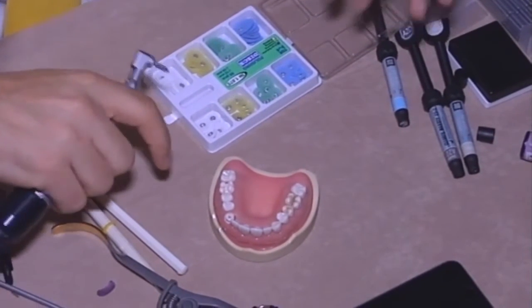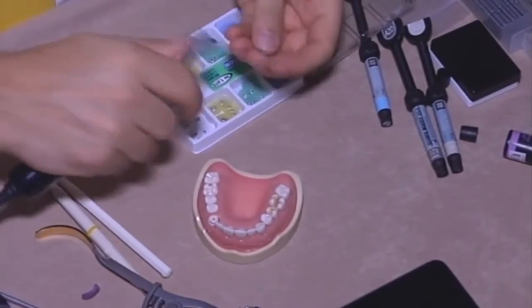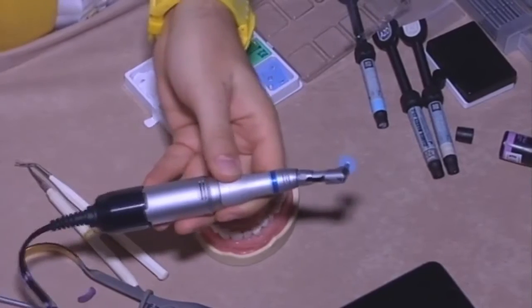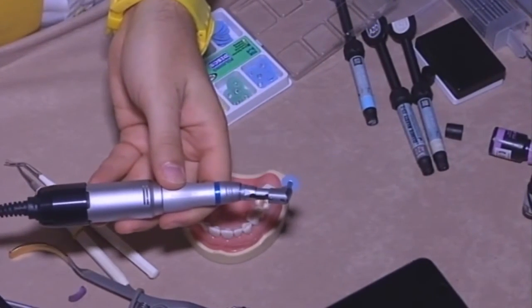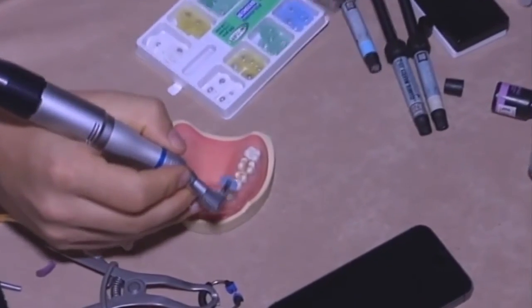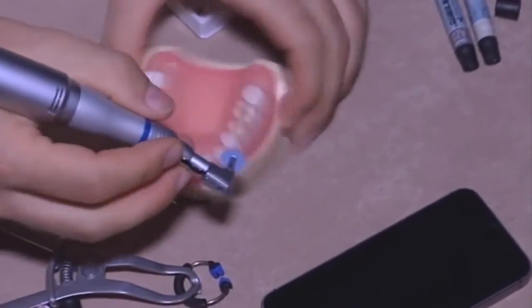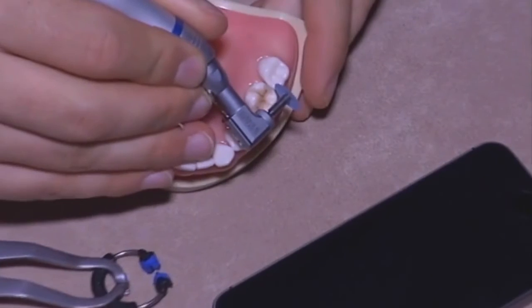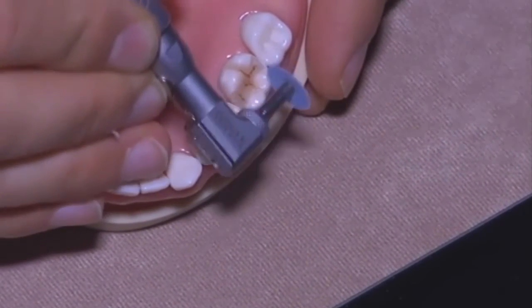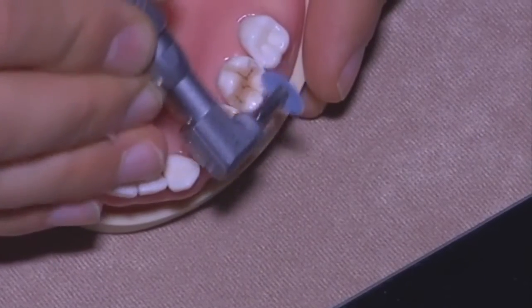I will try to save my fingers. And I prefer to work with disc slowly, because the first step is to finish the proximal areas.